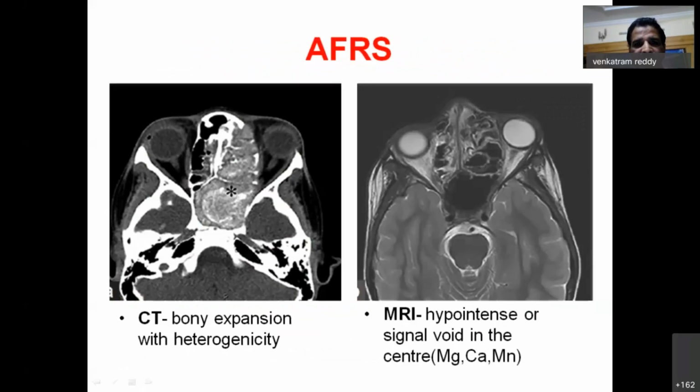Now, allergic fungal rhinosinusitis is again a very common clinical condition, wherein a plain CT scan of the paranasal sinuses may not give a straightaway diagnosis.